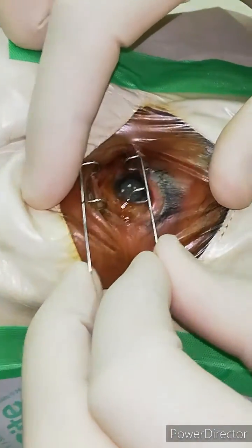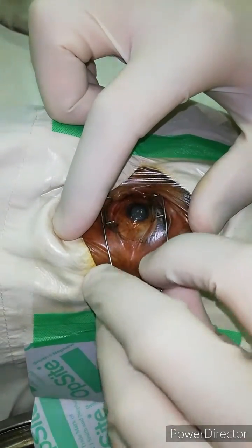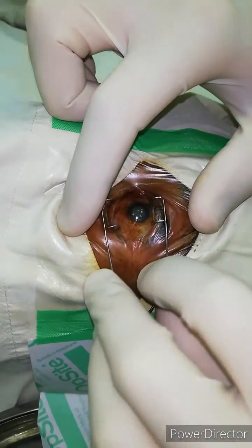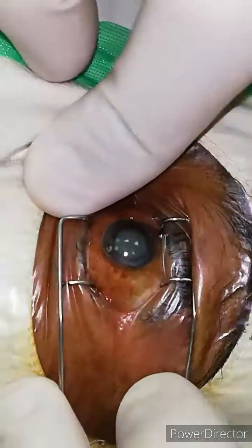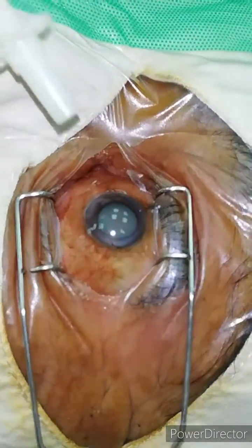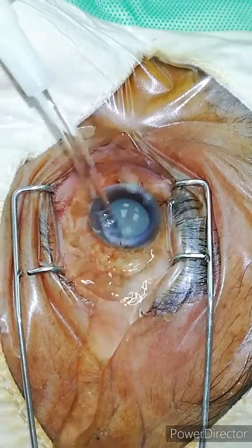So the speculum can be applied nicely. Look at the eyelashes, look at the surgical field — very nice and clean. I hope it will help the junior surgeons. Thank you very much. May it help. God bless you.